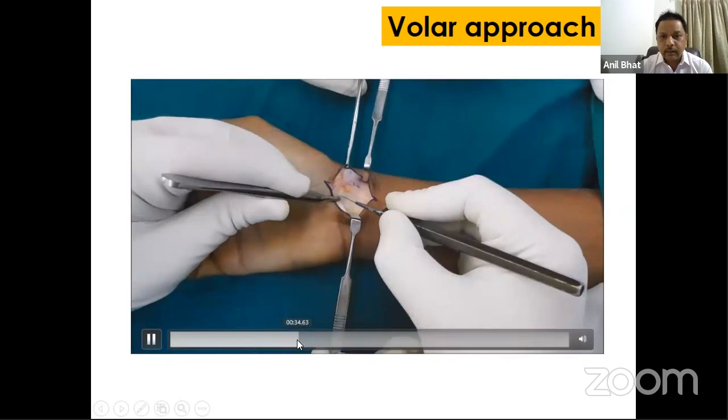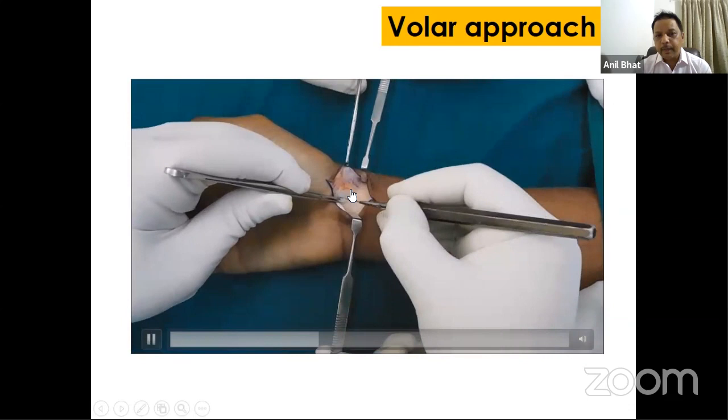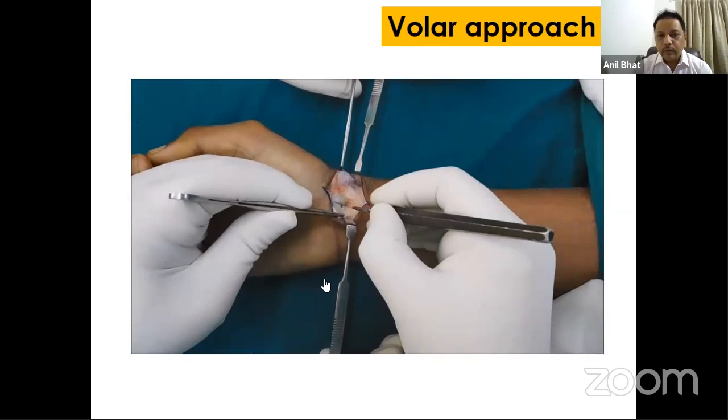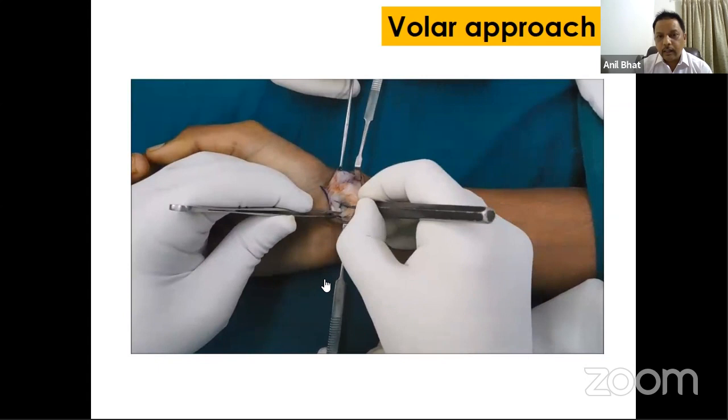There are different types of incision. There is a ligament sparing incision for the radiocapitate, a Z kind of incision. I prefer to go straight through and through in there so that I get a thick bite later to repair the capsule. So you go all the way in and you'll start seeing the fracture site there. It's a single cut till you get to the radiocarpal joint, all the way to the radiocarpal joint.